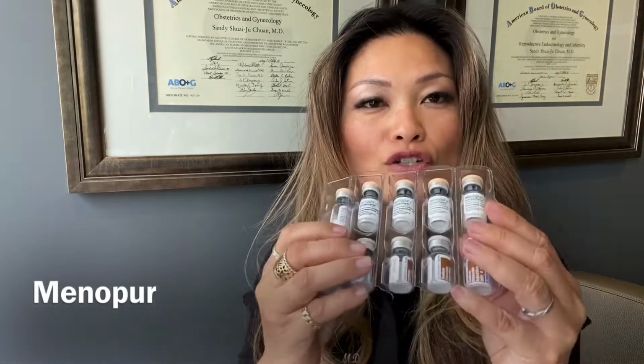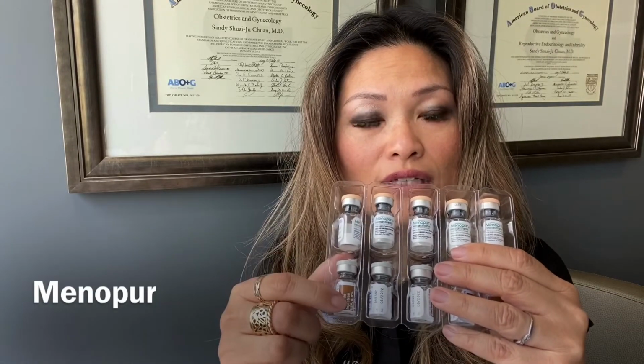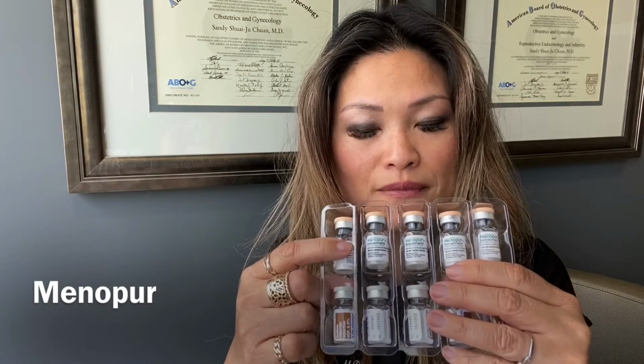So let's go ahead and start with the Menopur. So Menopur, again, comes in this green box, and of course this box is open, but you want to make sure yours is sealed, and most importantly, you want to make sure the vials are sealed. So typically you're going to get Menopur, which is the medication itself, in powder form in these little vials with a peach top, and then you're going to get saline, which is the salt water that you will use to mix up the powder, okay? And sometimes you're going to get a full box, and sometimes you might get these in loose form, because if you only need one or two, then you're not going to get the full box, but you'll want to make sure you know that the peach top are your actual medication.